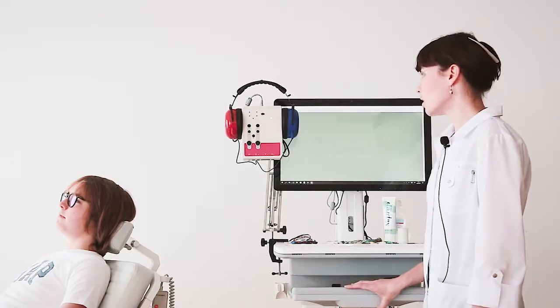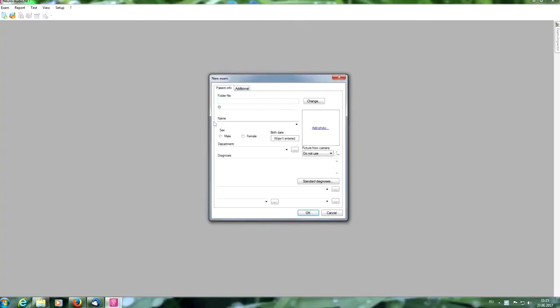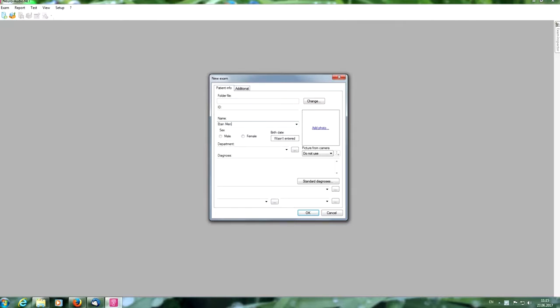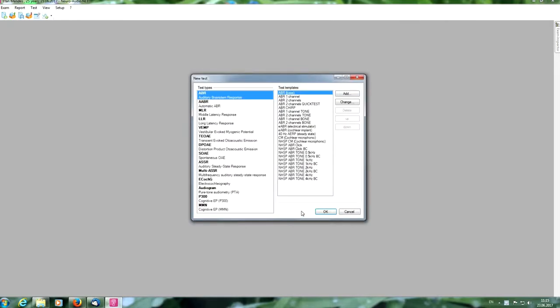Now we can run the neuroaudio.net program, press the New Exam button and insert the patient's data: name, sex and birth date, and press the OK button. Now we can see a lot of prepared templates for performing different types of tests. We need to choose the necessary one, for example the ABR for 2 channels template, and press the OK button.